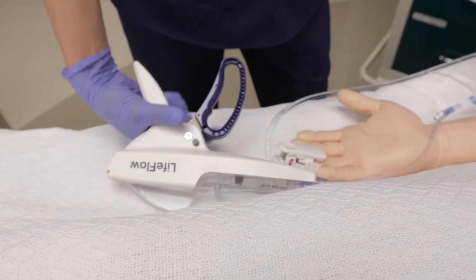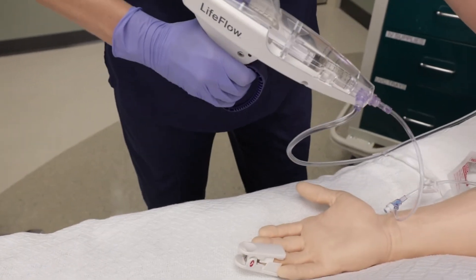As a replacement for push-and-pull, I thought it was ingenious. A process that sometimes would take almost two nurses to do correctly can be done with one person, and they still have a free hand, which is nice.